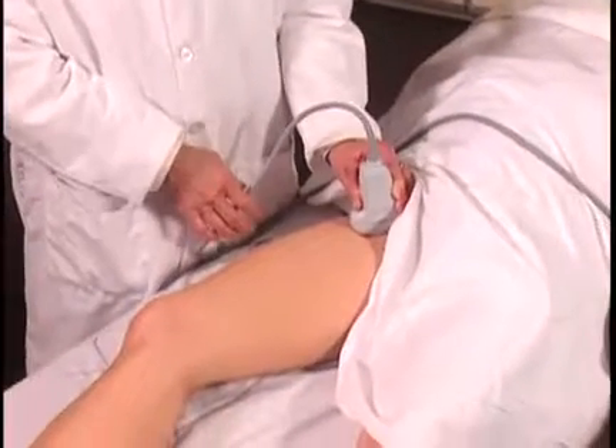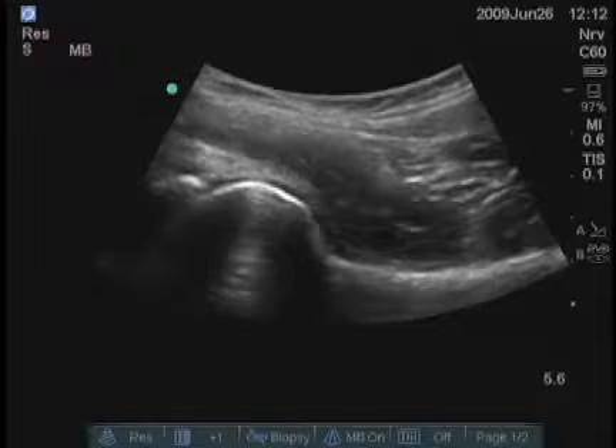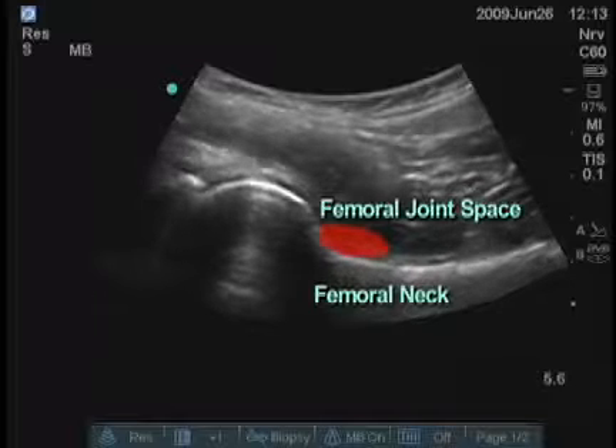The orientation will be the same as demonstrated previously. The image on the screen, the same as we've seen before, with the femoral neck being the target area.